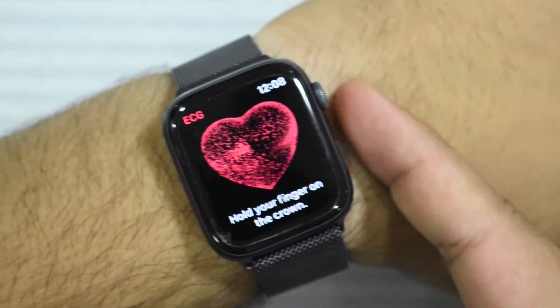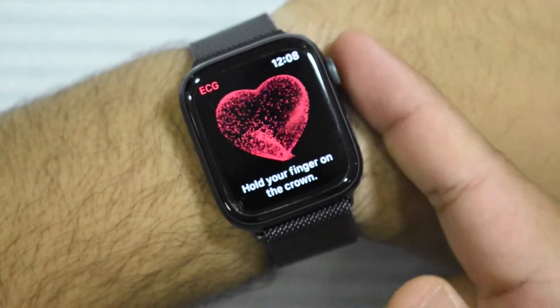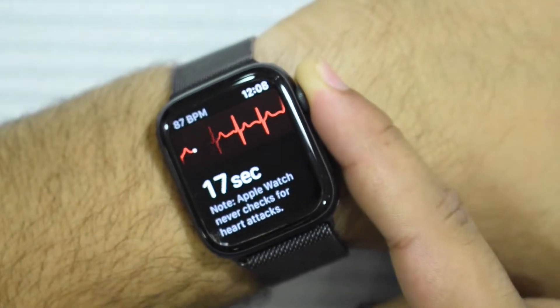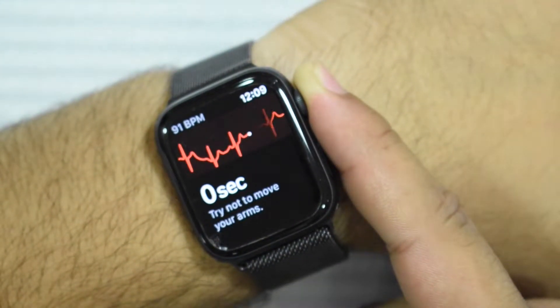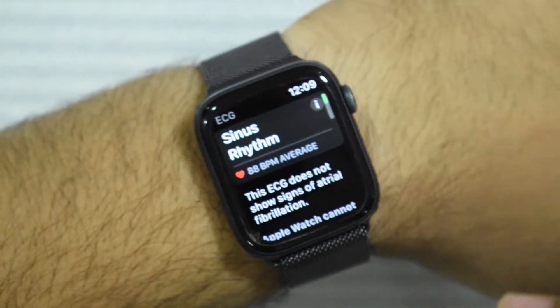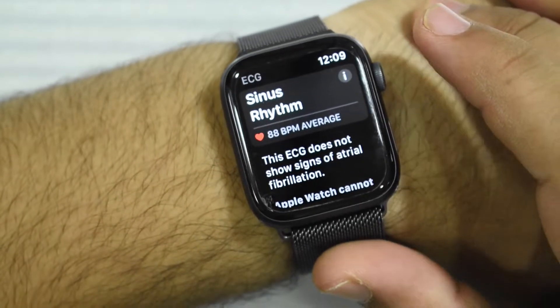Let me show you one more time right now. And there we go — sinus rhythm!